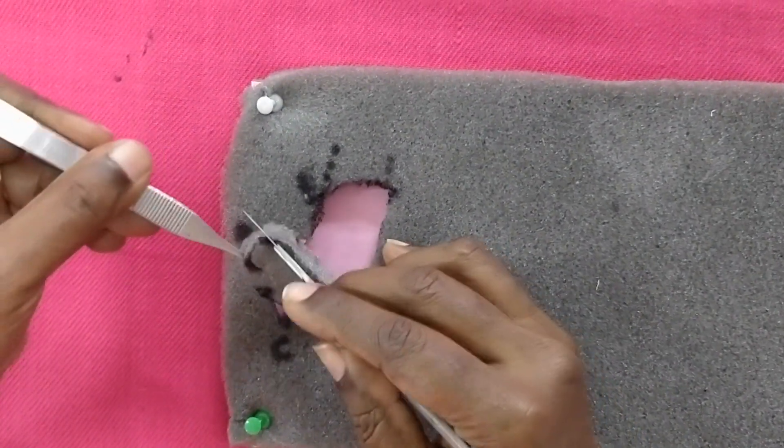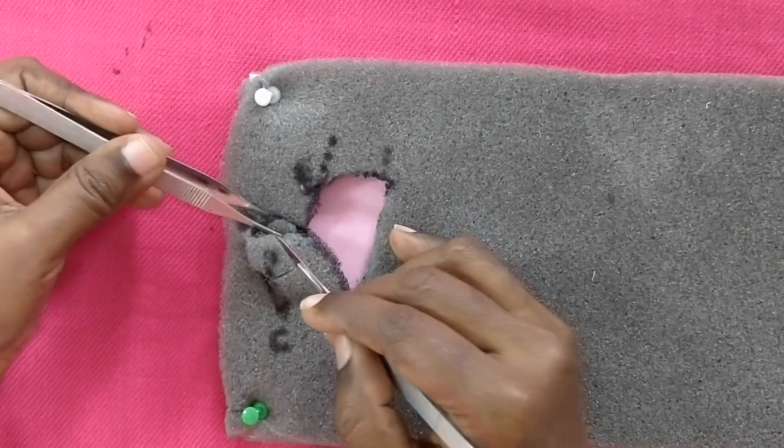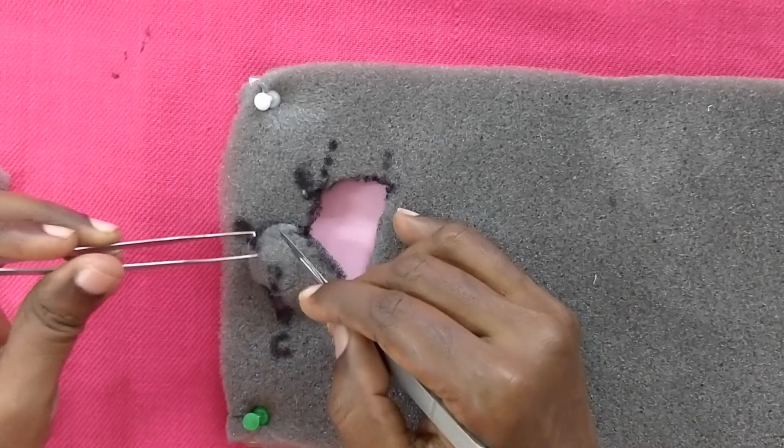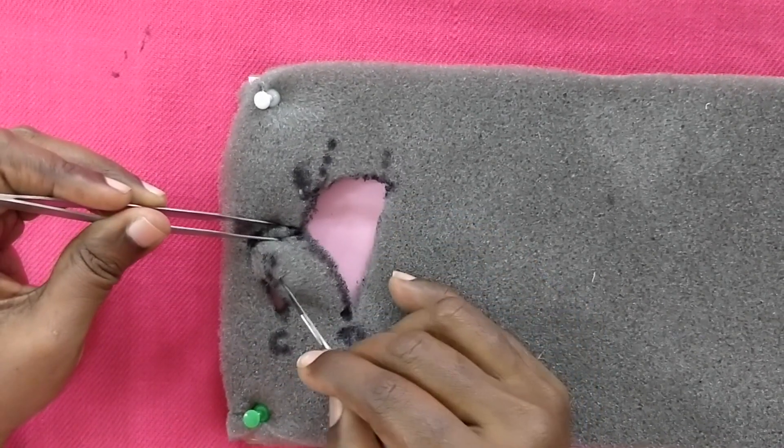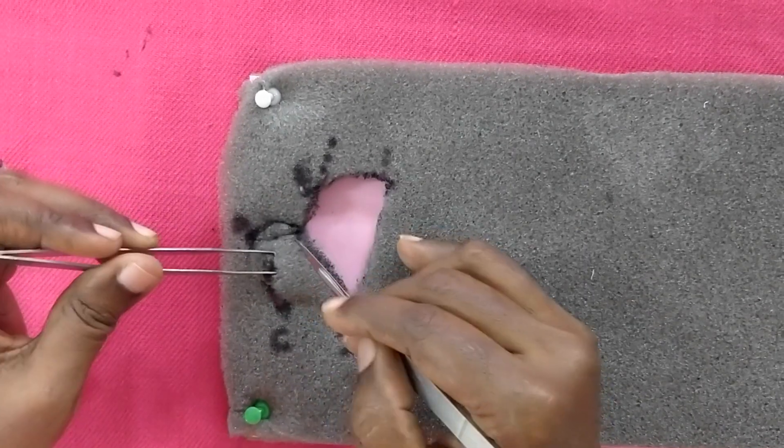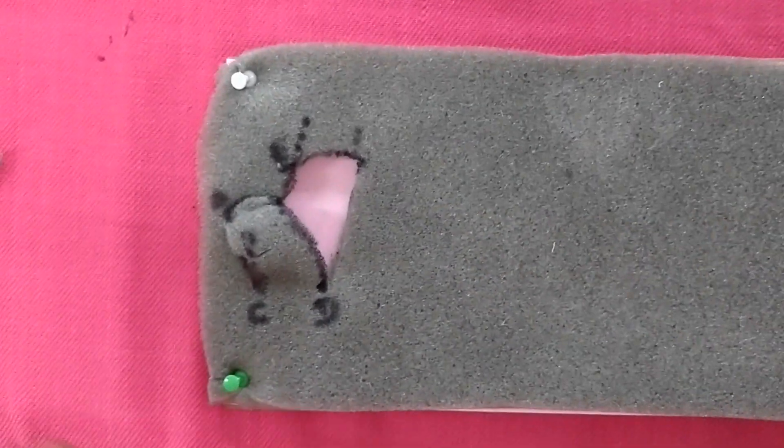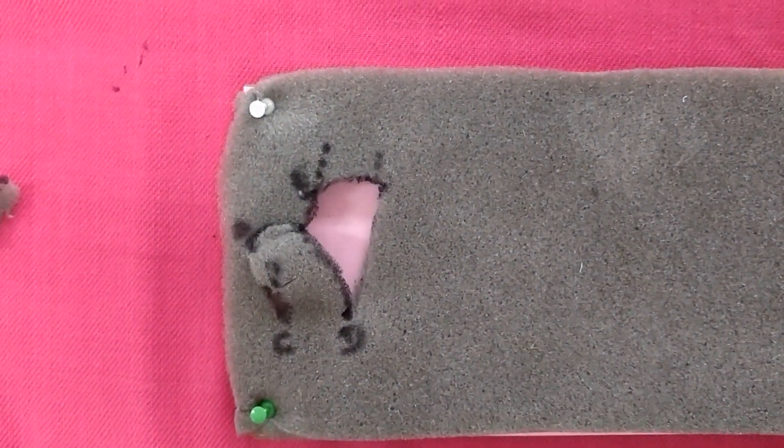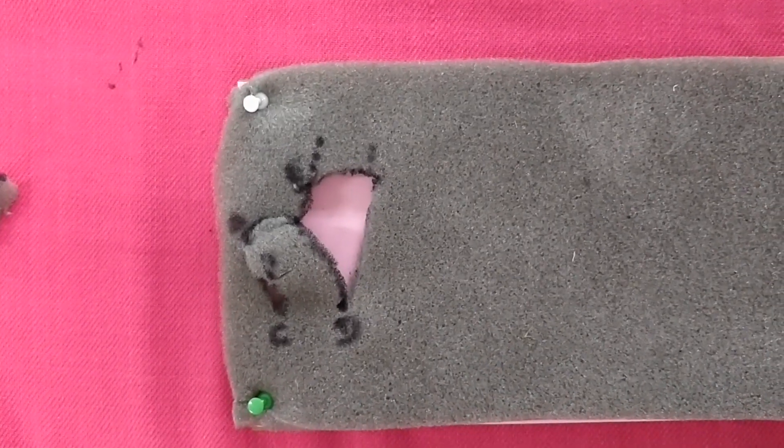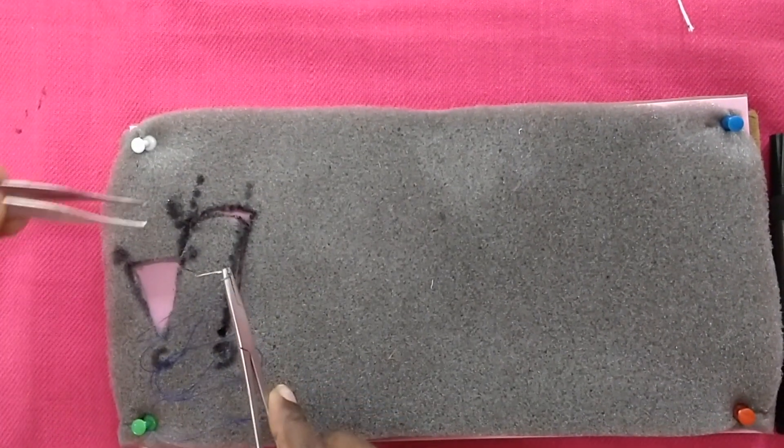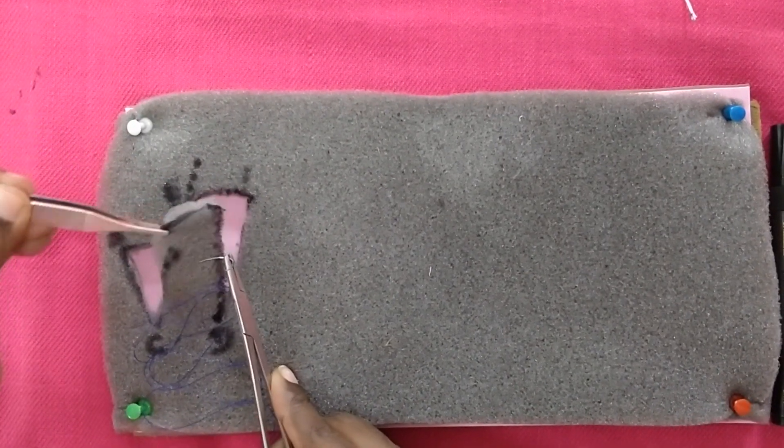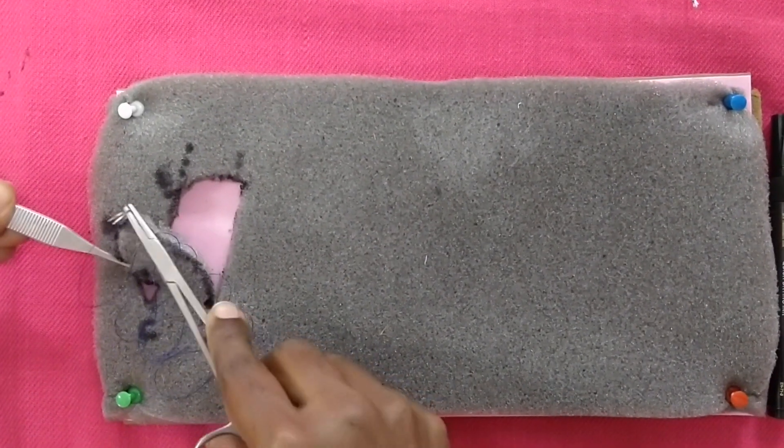The flap is now transposed to the defect and the leading edge, E, F, will be sutured to the edge A, B. Please note the bunching of tissue on the side A, C. This is what is going to lead to the dog ear. Now the sutures are taken.